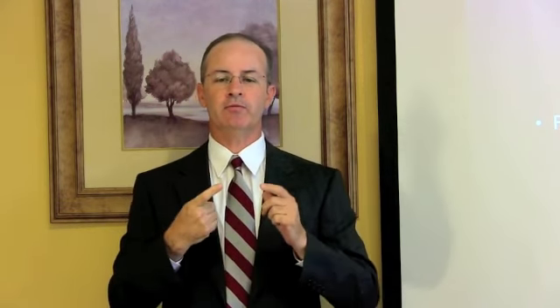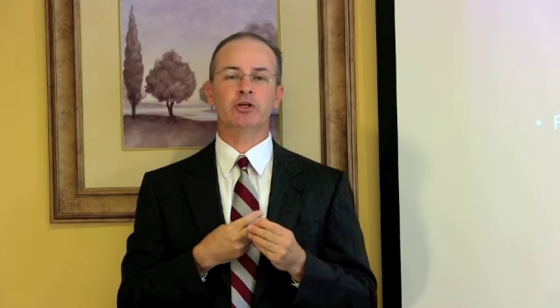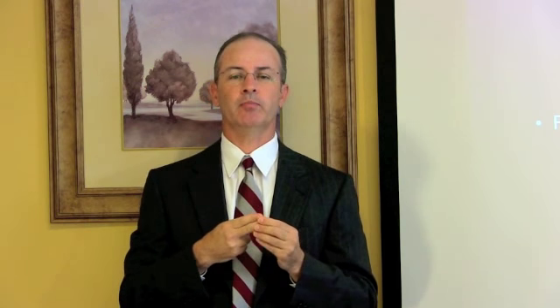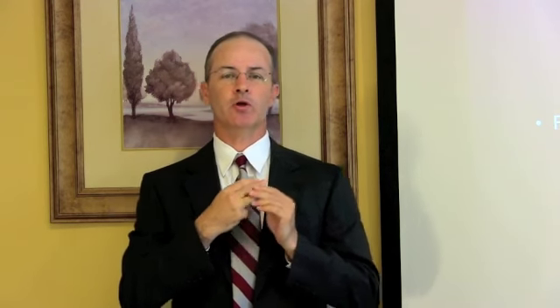So now that we have MRI techniques, and we have not only the NeuroQuant, which is the subject of this talk, we have susceptibility weighted imaging, which can show signs of old bleeding. We have diffusion tensor imaging techniques, which will often show objective signs of injury in our patients.